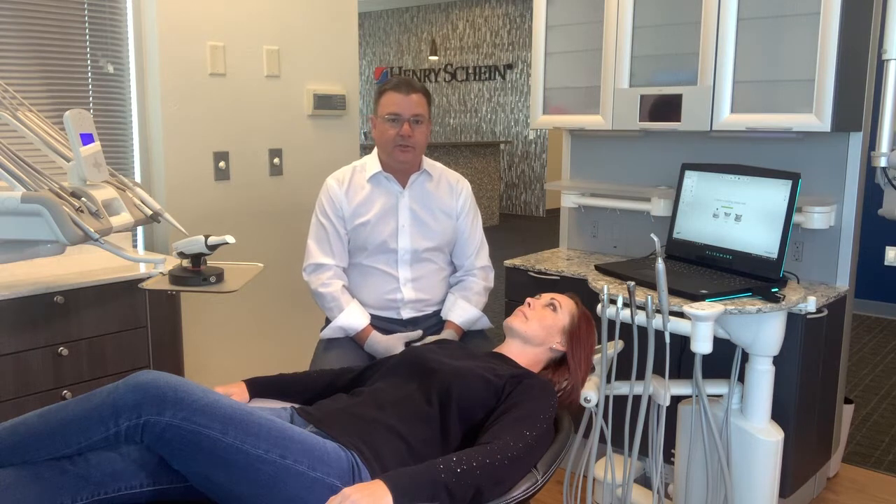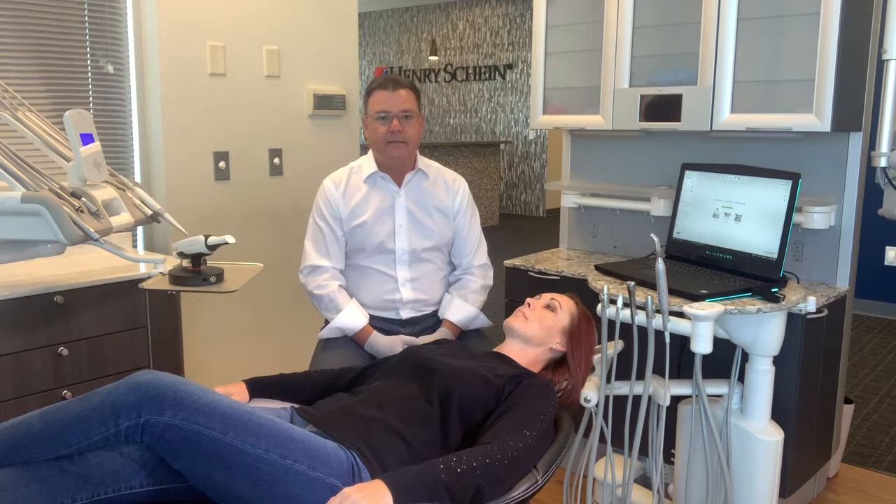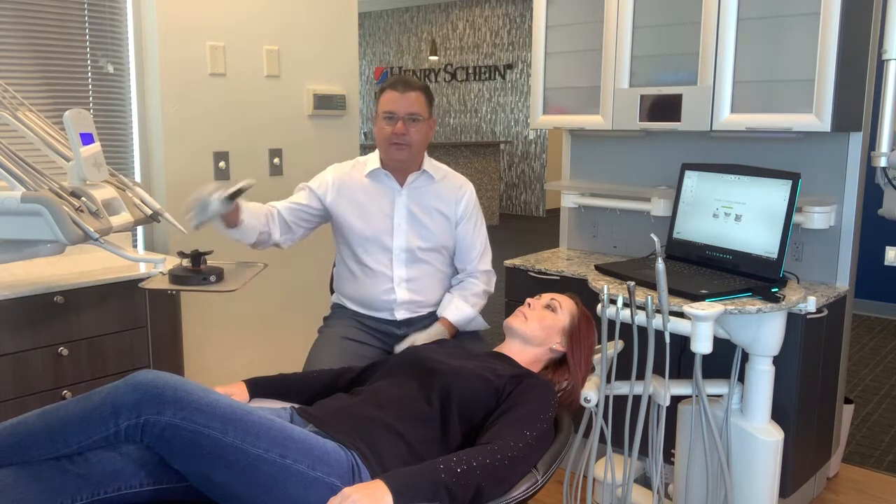Today, I'm going to show you how quickly and easily we can scan an upper arch, a lower arch, and then correlate the bite. You can do this for many different indications in your practice, but today we just want to highlight how easy and accurate it is. So with that, we'll get started.